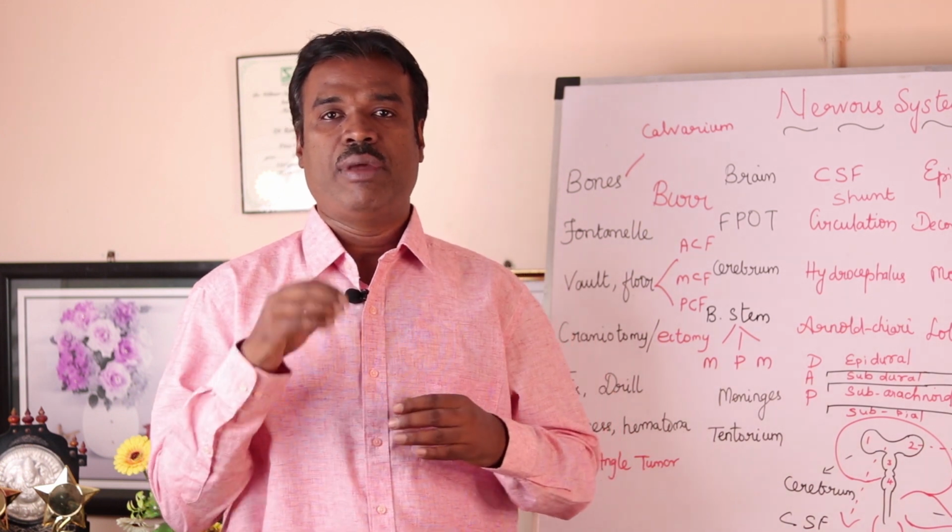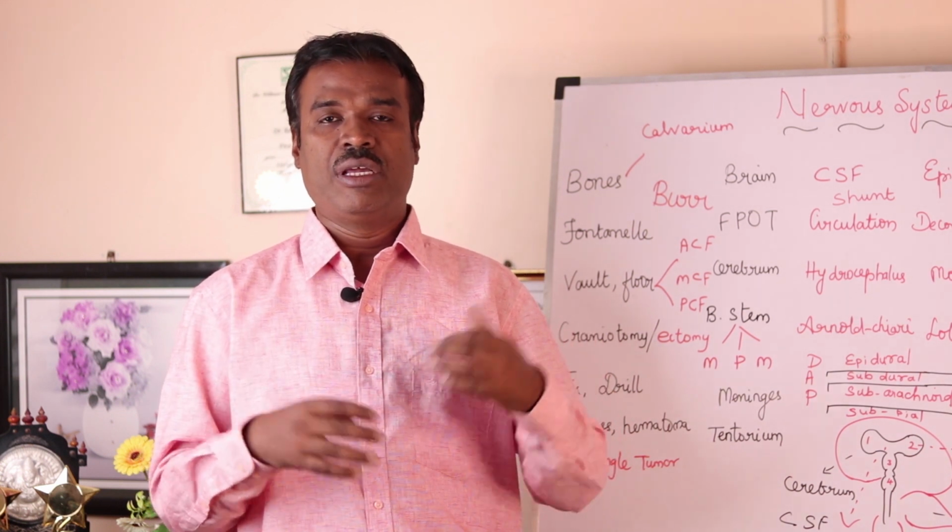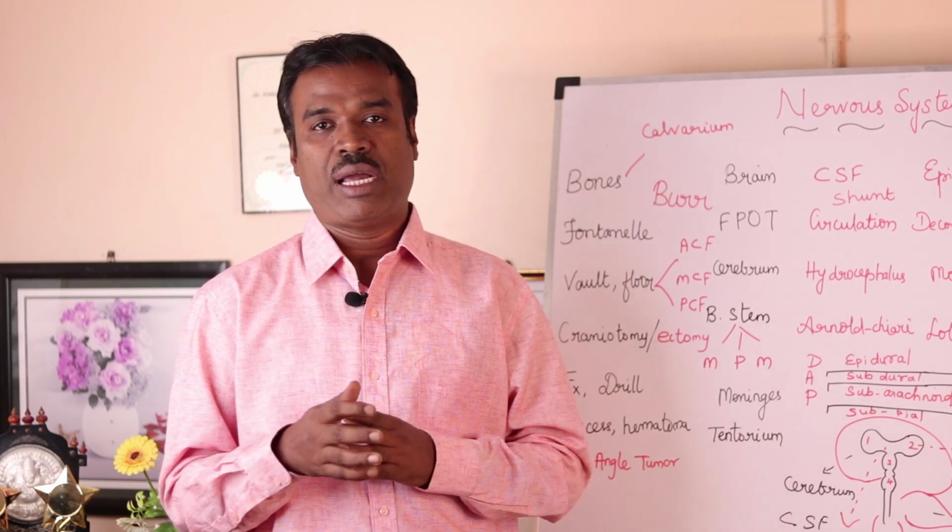So when the physician makes use of three-dimensional techniques, then we call that stereotactic radiosurgery.